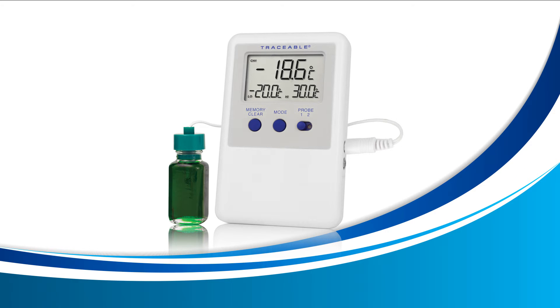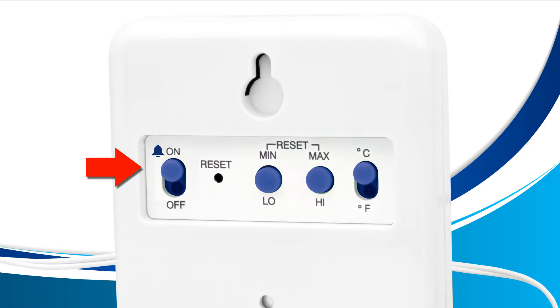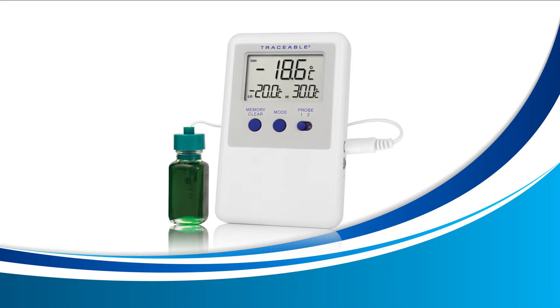Stopping an active alarm. There are two ways of stopping the alarm — let's take a closer look at each one now. The first way is to turn your alarm off by sliding the alarm switch located on the back of your device to off. You'll notice the correct switch as it has a small bell right beside it. This method will turn your alarm completely off. The second way to acknowledge your alarm is to press the memory clear button on the front of your device. This method will stop the current alarm but it will also continue to alarm you for new alarms.